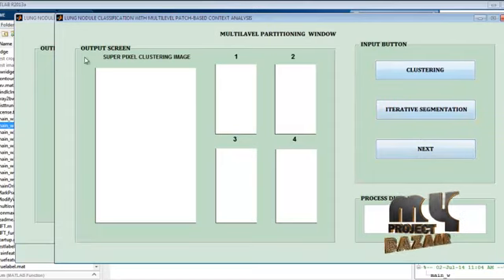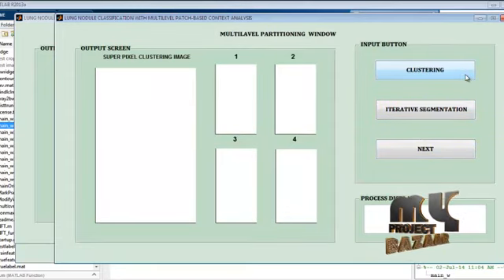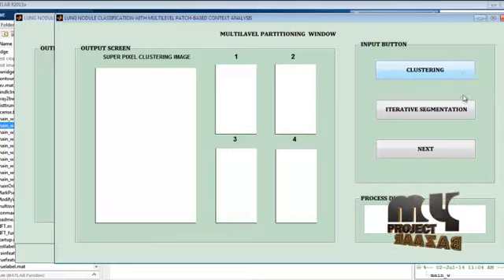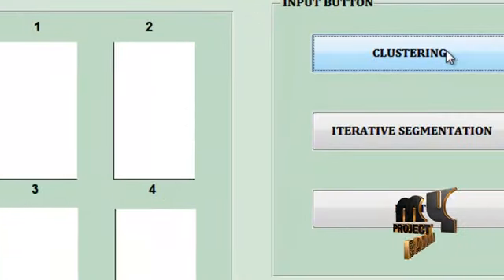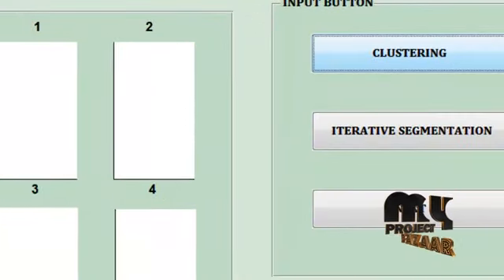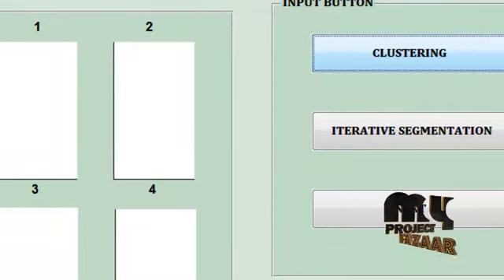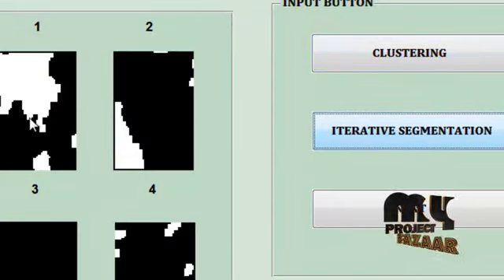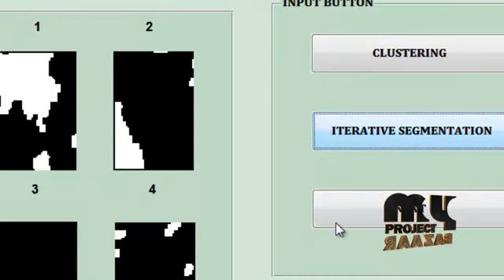Then go to the multilevel partitioning window. This window includes the clustering method and the iterative segmentation process. The clustering method clusters the superpixel image, and then iterative segmentation produces four types of segments for the clustering input image.